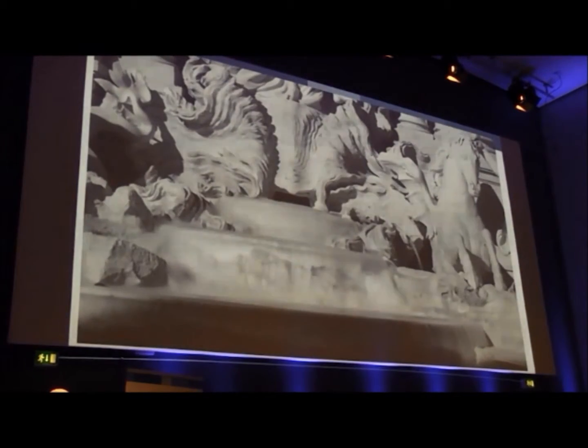So what I did in order to clarify this is I went to the Trevi Fountain in Rome and took a look at it. I took my iPhone and put it on the side of the fountain, and I wanted to see if it was possible. Could I make an OCT angiography of the Trevi Fountain?